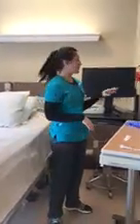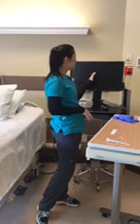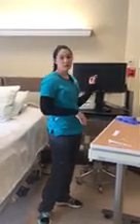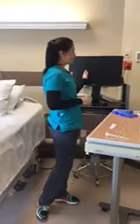So the first thing I'm going to do is go ahead and check the MAR, and I do see an order from Dr. B. I'm going to compare that to the MAR that I see 40 milligrams of the Lovenox. So the concentration there is 10 milligrams per 0.1 mils. So we are going to administer 0.4 mils of that Lovenox. And I do see it is to Bob Johnson in room 115.